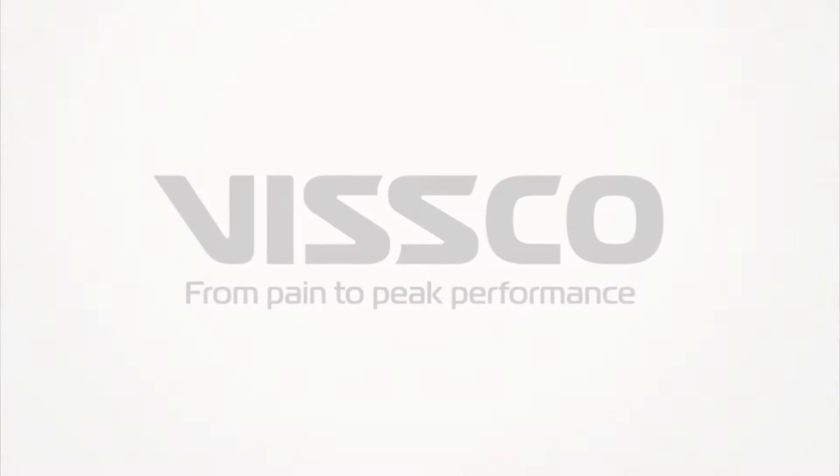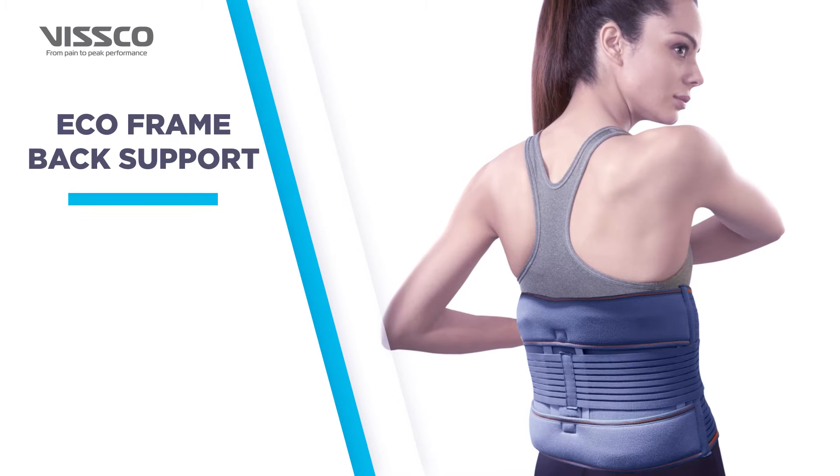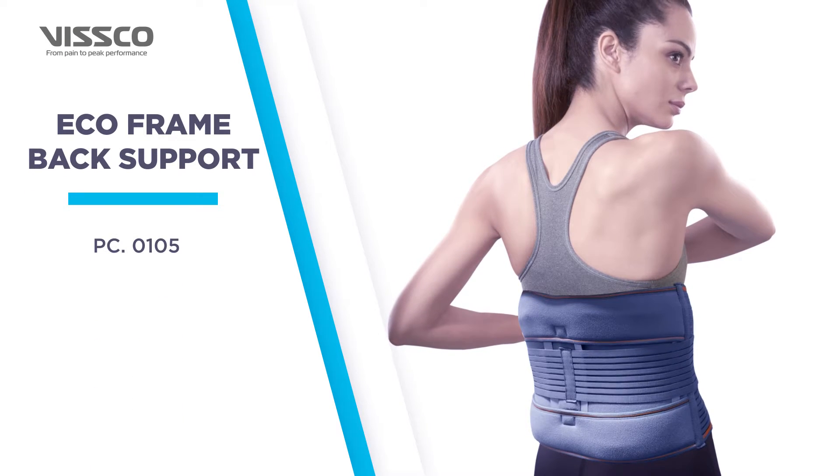Greetings from Wisco. Let us now see the Wisco Eco-Frame Back Support, Product Code 0105.